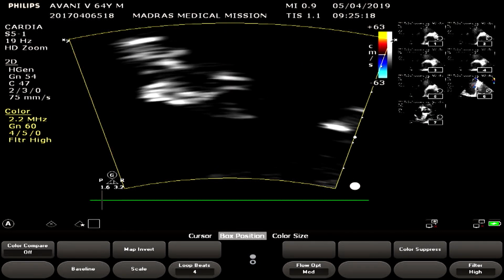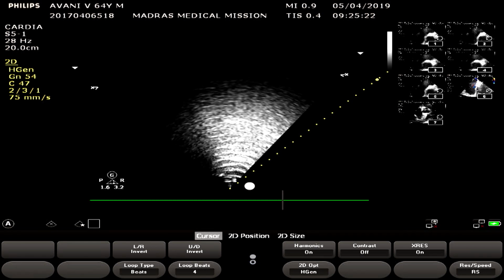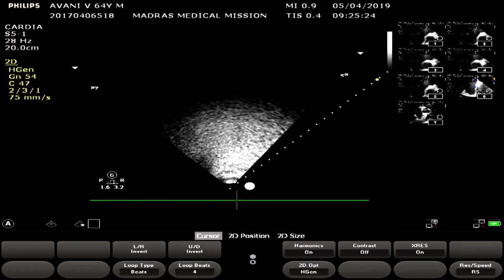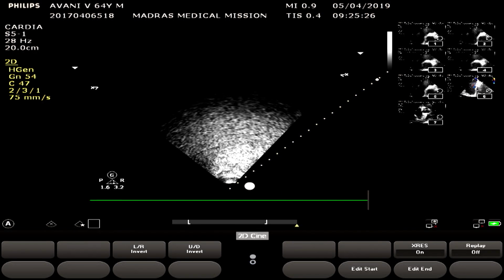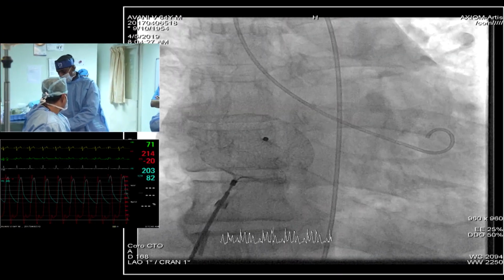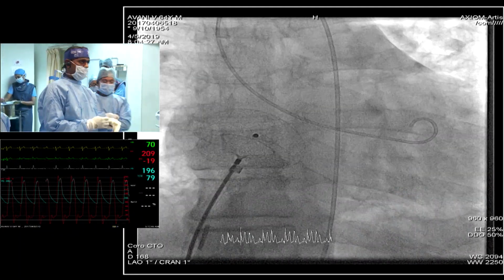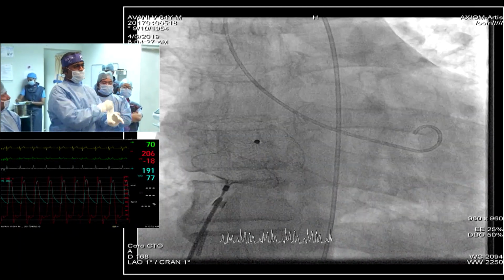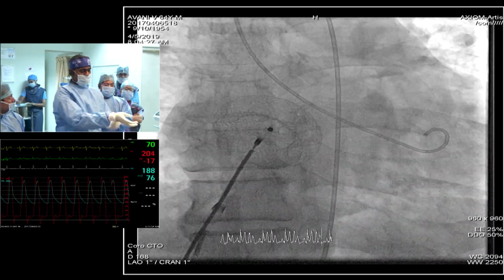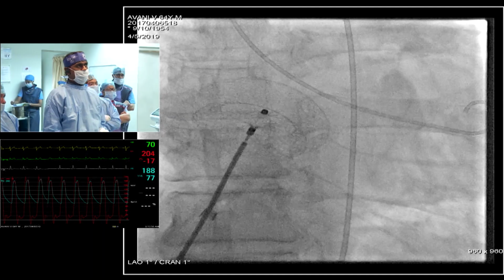It's looking quite good. About embolization, we too had our share of embolization, but we have overcome it in the last maybe 10 years or so. We had a learning curve when we started using the Amplatzer products in the early 2000s, but now I can say that this device is reasonably secure.